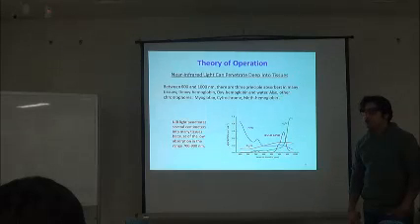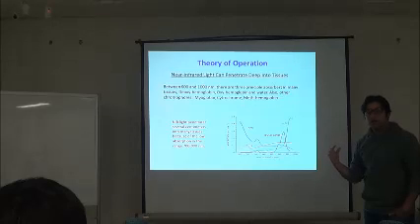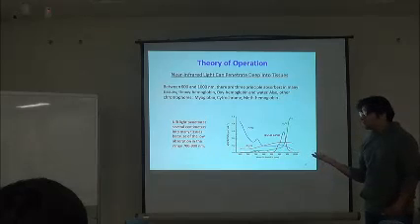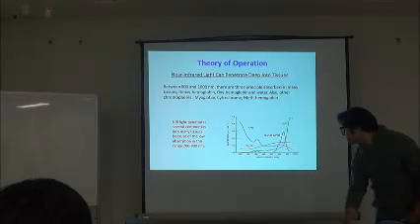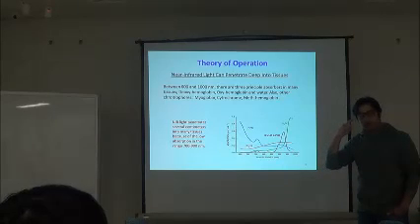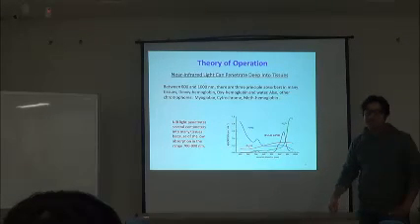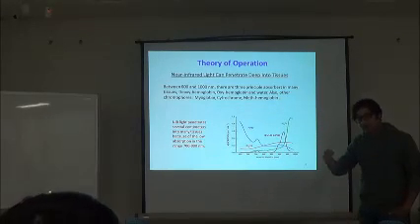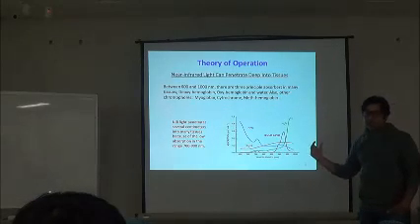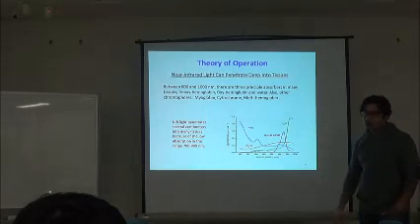After the firing of neurons, the neurons require glucose and oxygen to become active, and that oxygen is provided by the oxyhemoglobin. So after there is activity, the blood oxygenation level flow to that area increases, and because of that increase, there is a rise in the oxyhemoglobin and a decrease in the deoxyhemoglobin, and the total hemoglobin, which is the sum of these two, almost remains constant. Not really constant, but usually it almost remains constant.